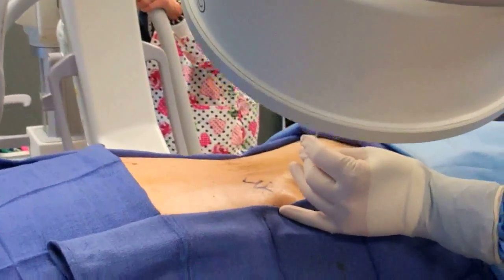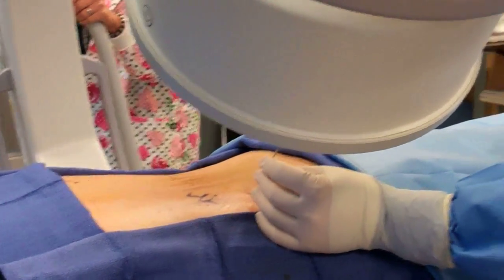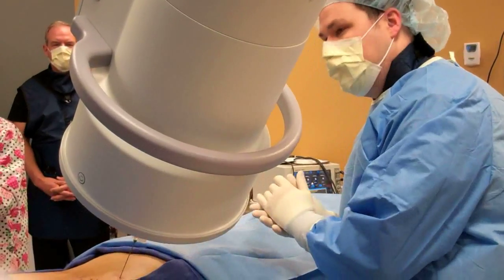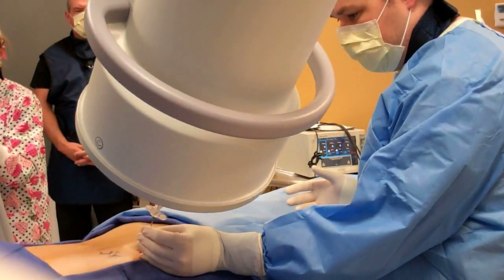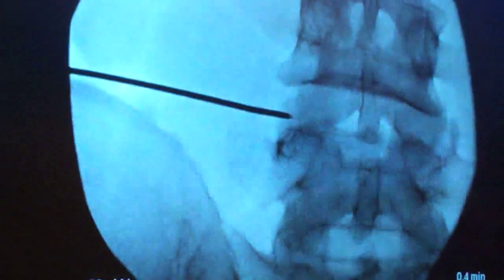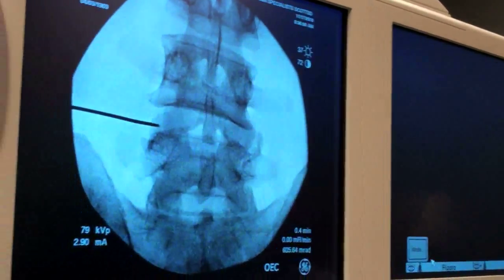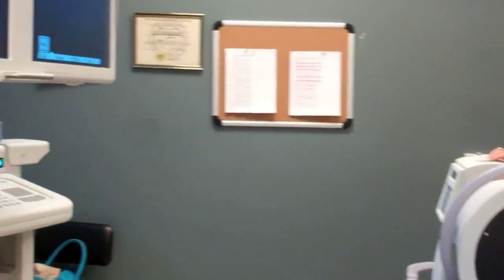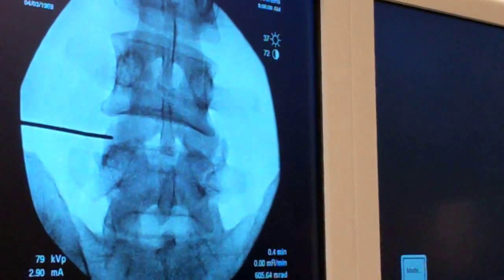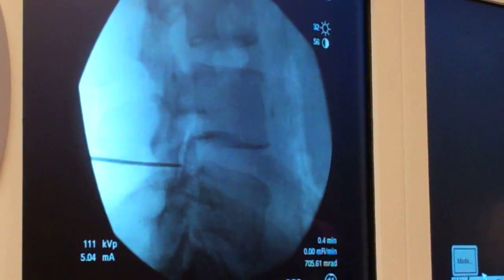You're going to feel a little bit of pressure here, Robert. All we're going to do is come in with a gun-barrel approach there. We'll come to AP and keep on this view here. So we're getting real close to the disc here. We'll look on a lateral view now. Okay, just a little bit away from that disc — we'll come in just a little bit superiorly and enter into the disc.